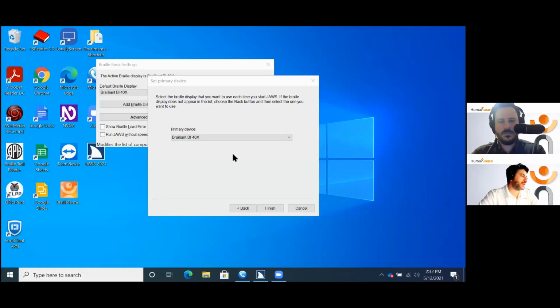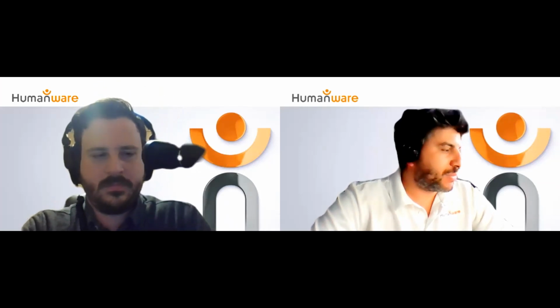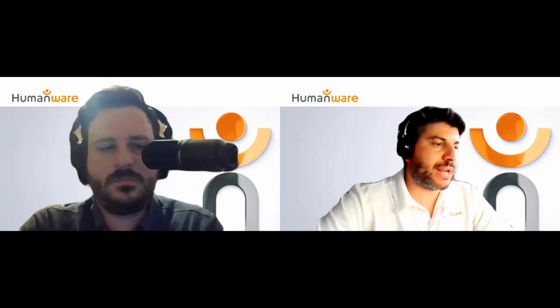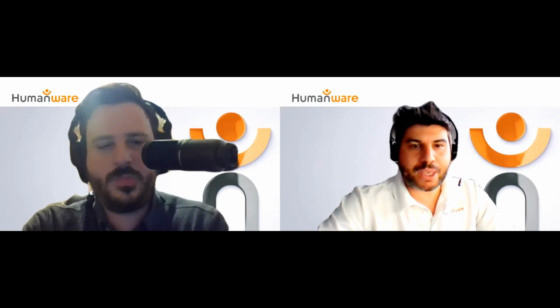Awesome. Thanks very much, Peter. And I hope that was a great presentation to get you started with our Braille displays and JAWS. So now over to me. I'm going to show you how we can connect our Brailliant BI X Series to an iOS device, and again show some basic commands that we're going to be using within iOS.